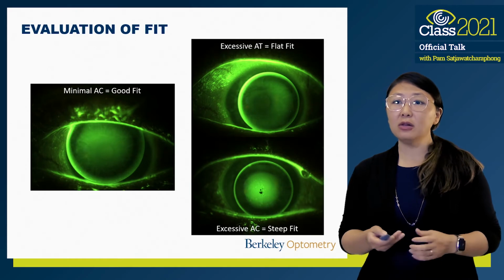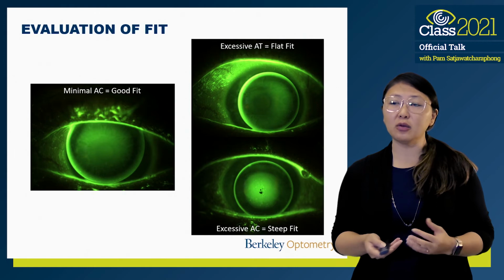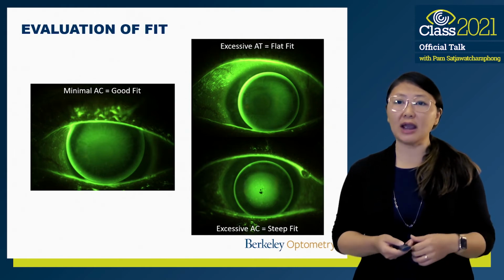So looking at all three of these in comparison, hopefully you can start to see some of the patterns that you'll see when a lens is too flat or too steep versus when it's more ideal.